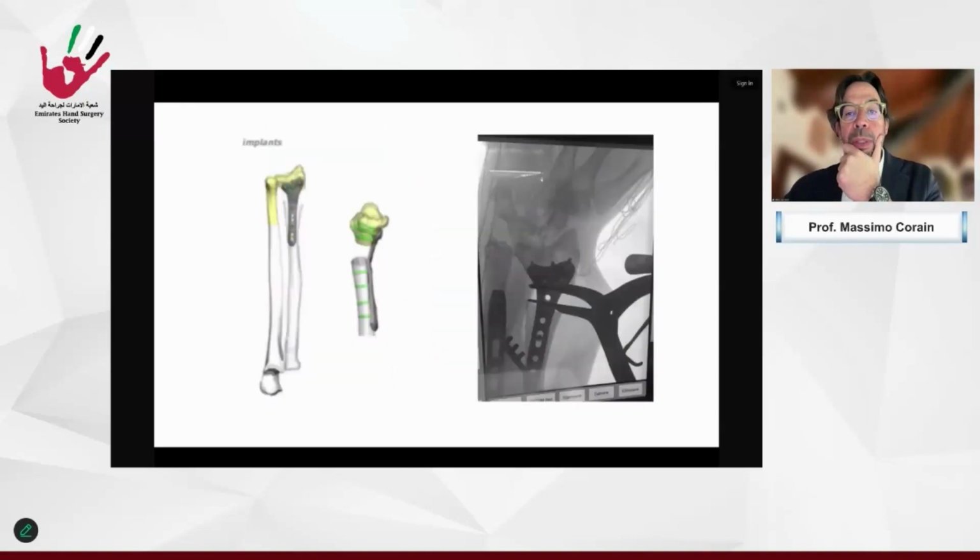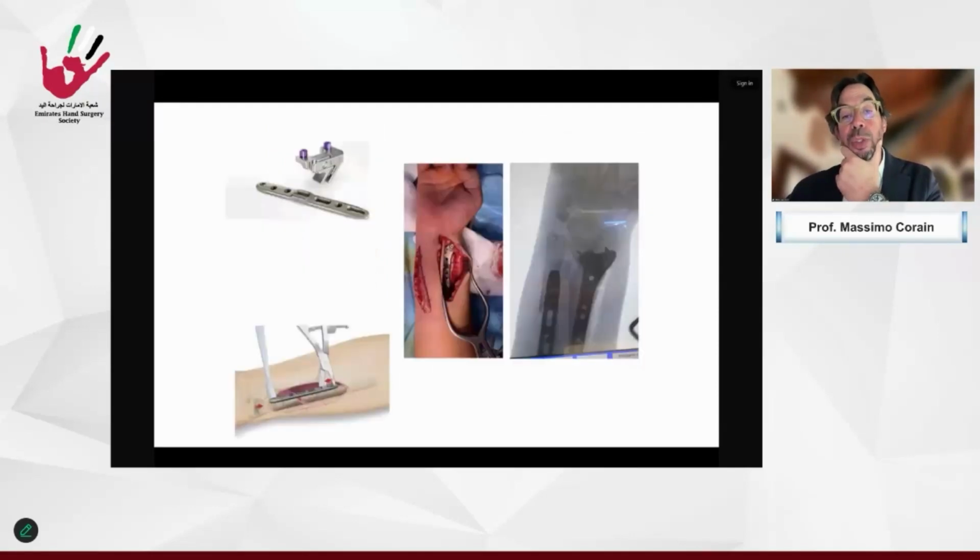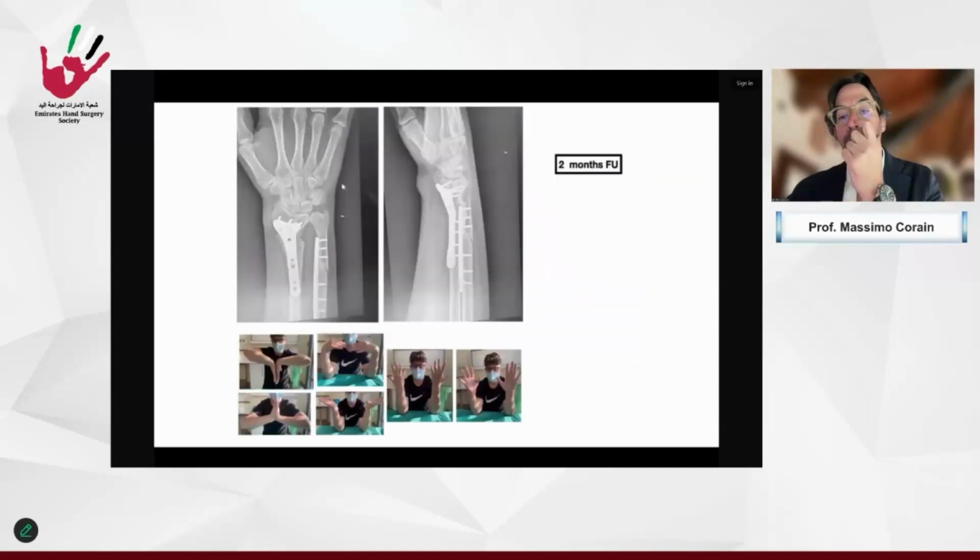These are some intraoperative steps with the osteotomy line, the pre-drill holes for the screws, and the proximal wire guides. And these are the intraoperative steps as decided before surgery with the planning and the shortening of the ulna and synthesis of the radius. And this is the radiological and clinical check after 2 months from surgery with very good results in cosmetic and functional aspects.